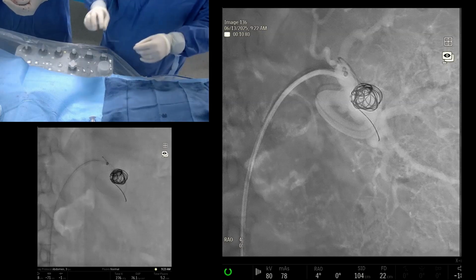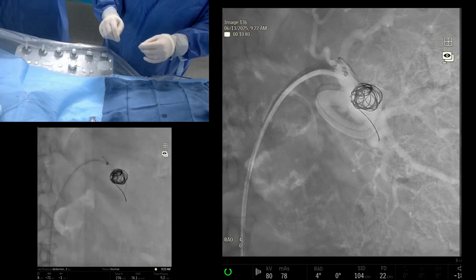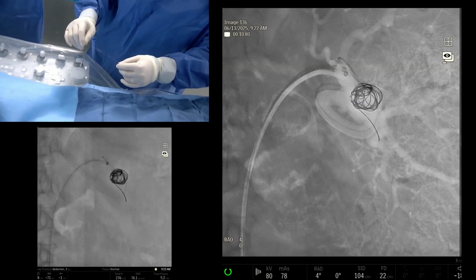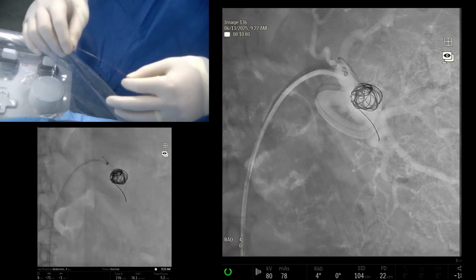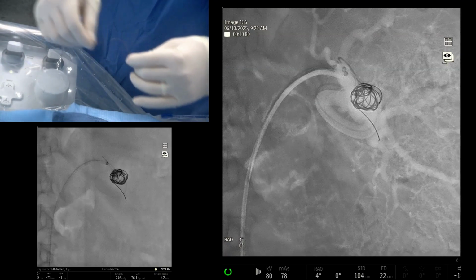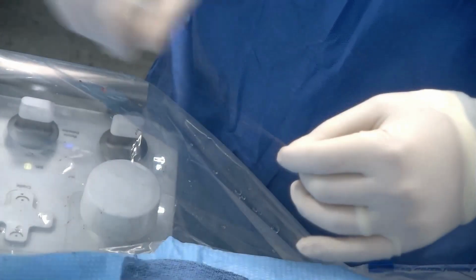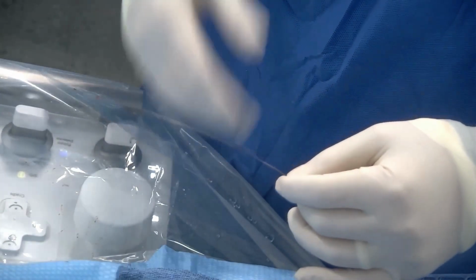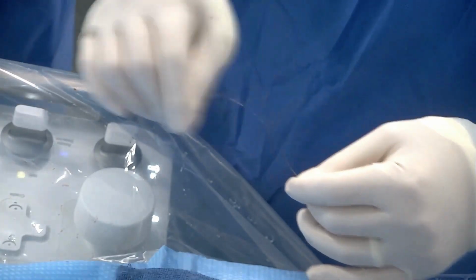This is a nitinol pushing system, so it works quite well around the tortuosity, as both of you had mentioned, and it won't kink, which is sometimes a source of consternation for some people. I assume the camera is at my hands, and with nitinol you can really bend it back and forth and it won't kink. Sometimes with the older platforms with the steel mandrel, you'll be pushing against some tortuosity and you'll have a kink, and that really limits the ability to push through. So this is quite nice.